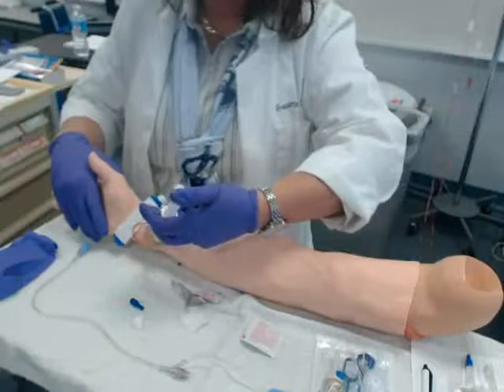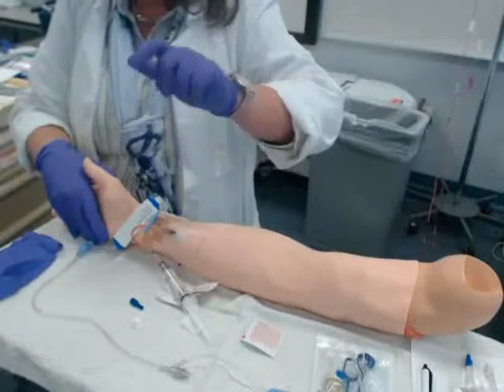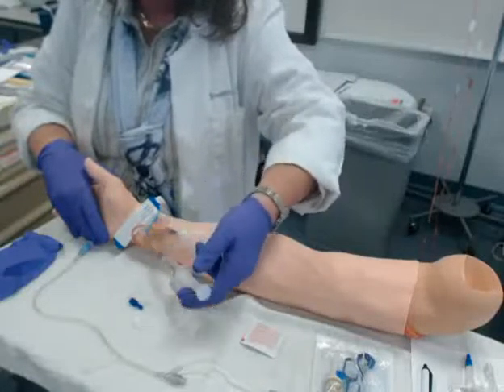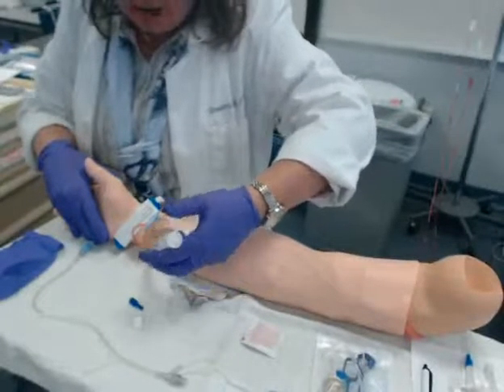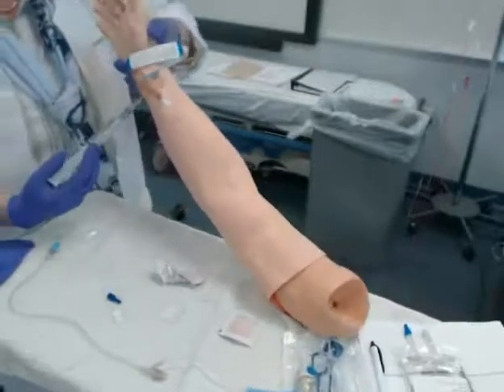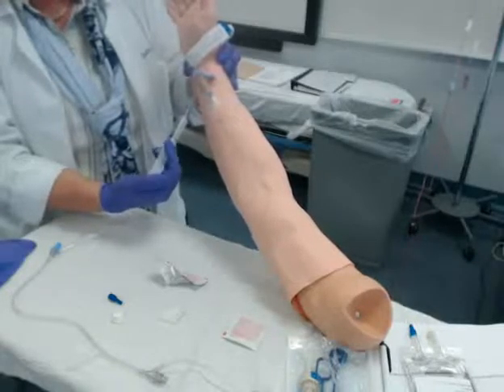I'm going to aspirate — I'm going to turn my hand over so you guys can see. You know what? I didn't turn my blood on this morning — stay secure, side rails up. Disregard the blood tubing; that's just so you guys get a blood return. So I am going to aspirate, just looking for a flash there in my catheter. Once I get the flash, I know that I'm in the vein — that's my first sign. Now I'm ready to instill my saline. Remember, I'm only using 5 milliliters.